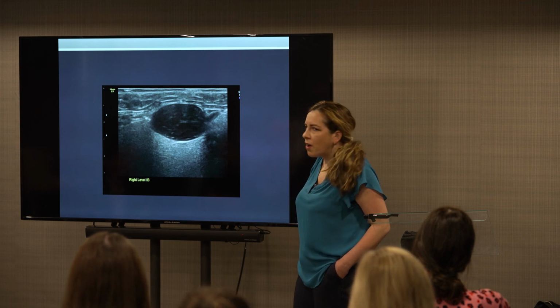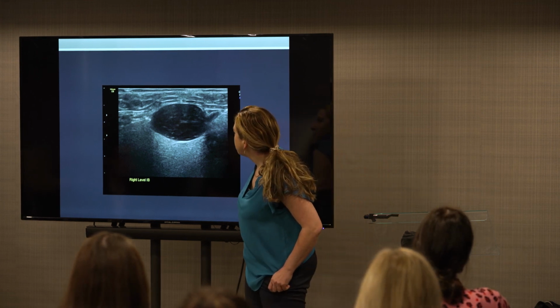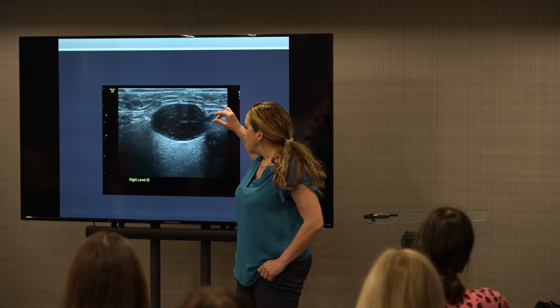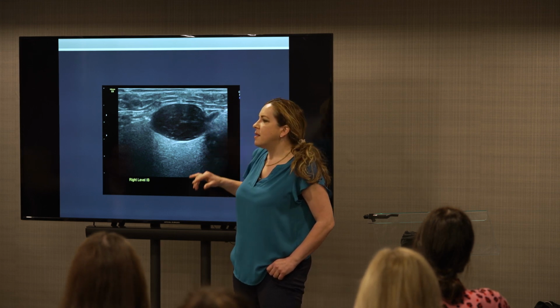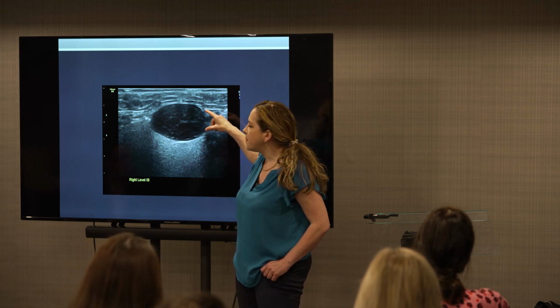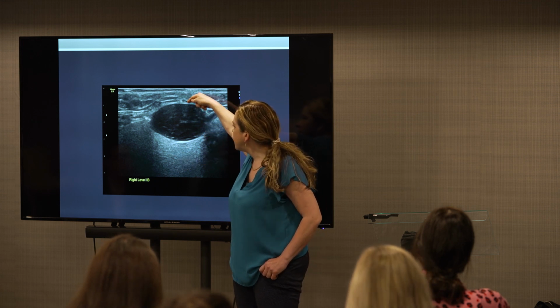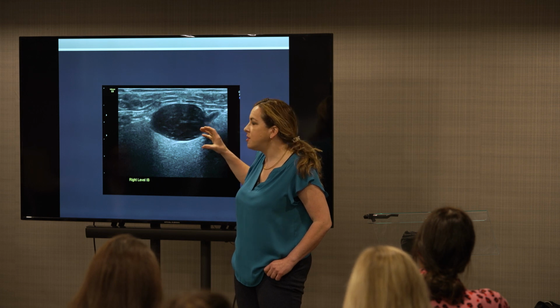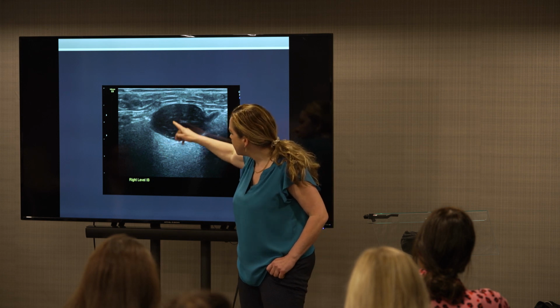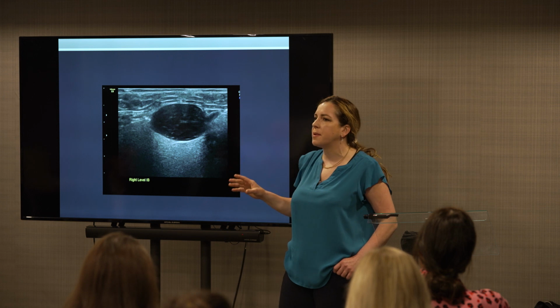So this is a bit of a trap. I think Vina might mention this later, so I don't want to step on her toes. But I just wanted to mention, because I said about cysts and posterior acoustic enhancement, but there are also things that are not cystic that show posterior acoustic enhancement. So this is a solid lymph node. It'll be a lymphoma, which is usually the classic pseudocystic thing. And the sound beam, just because of the constituents of the node, is traveling really easily through the node. So you get this posterior acoustic enhancement, but it's still solid. So it's a trap, it's a trick.